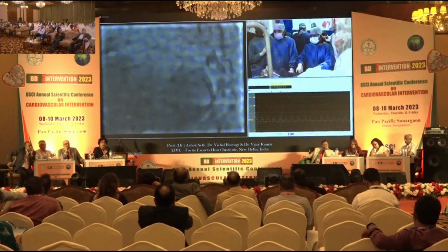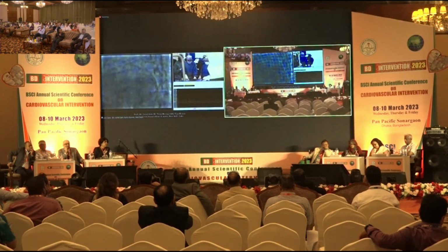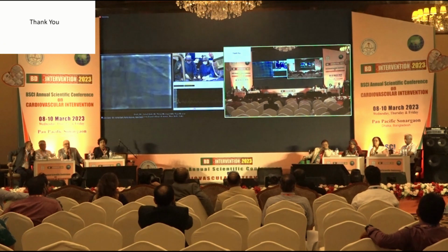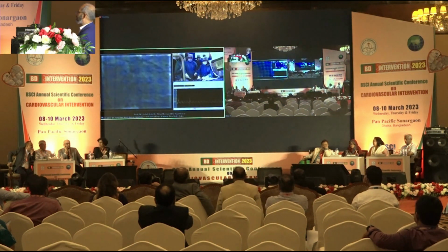So, sir, it looks like multivessel disease and double bifurcation. Any comment from our panel? Professor Fazilatur Malik, would you like to make any comment?